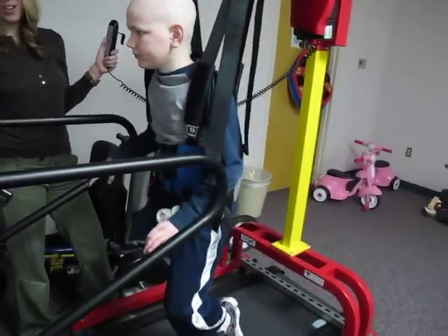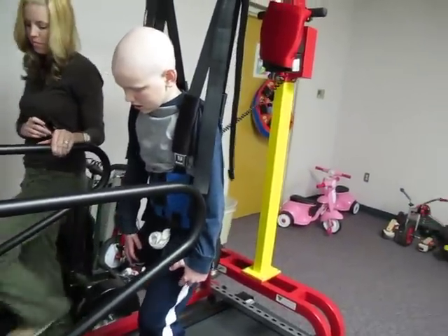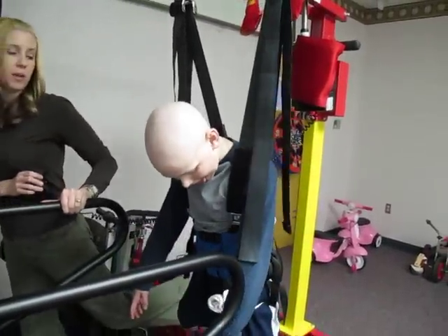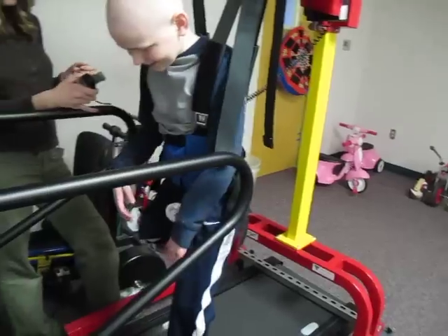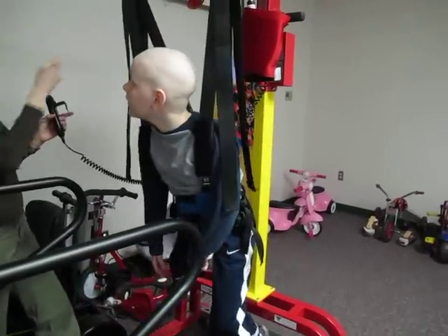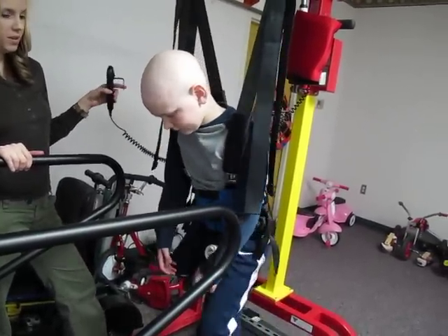Let's do it real slow. See how slow you can take a really good controlled step. And when I say controlled, I want your big heel landing and then pushing all the way up. See how far you can make your leg go all the way back before you have to take your toe up to put it back forward. I hit the bar — yeah. I can turn you around next time. We can put you in it where you face this big bar back here too, if we're going to work on things where you need to extend your leg out so you don't kick the bar. But usually if we're walking, we do it like this.